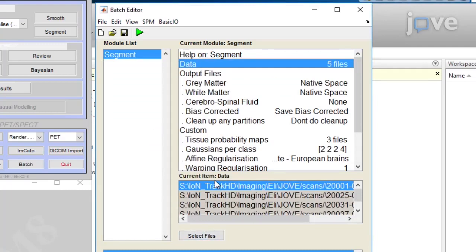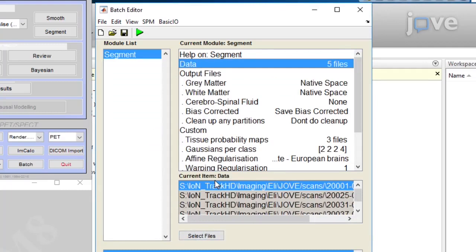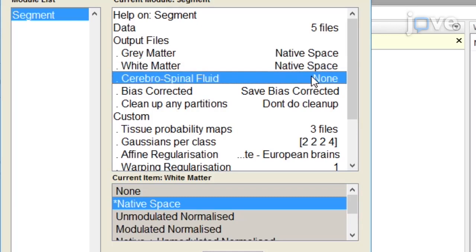Next, click on Output Files, Gray Matter, and ensure that Native Space is selected, and repeat this for white matter. If the CSF segmentation is not required, leave this set to None.